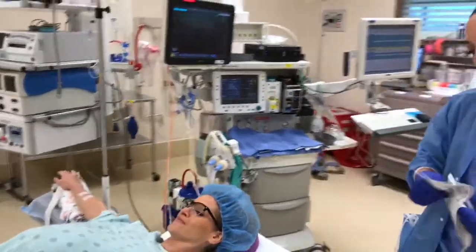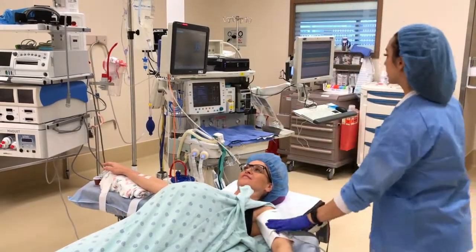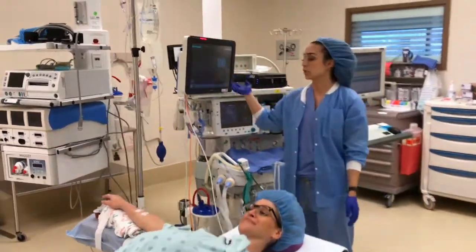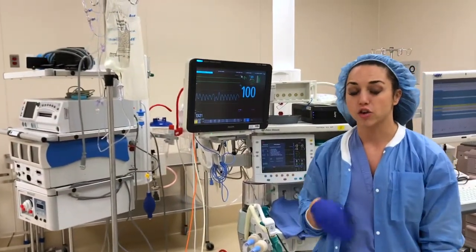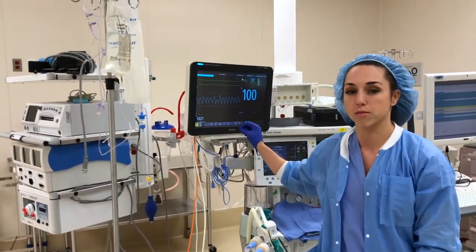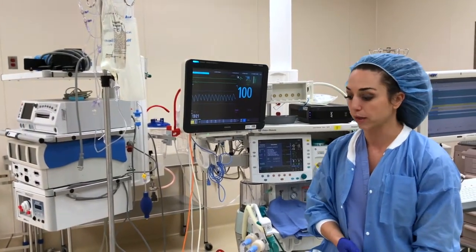And then we'll place our blood pressure cuff on the opposite arm. Okay, we'll relax. Remember to cycle. Usually you can start with a 3-minute cycle. Once we lay down after the neuraxial, it'll be important to change that to a 1-minute interval to monitor hypotension or sympathectomy response from your spinal anesthesia.